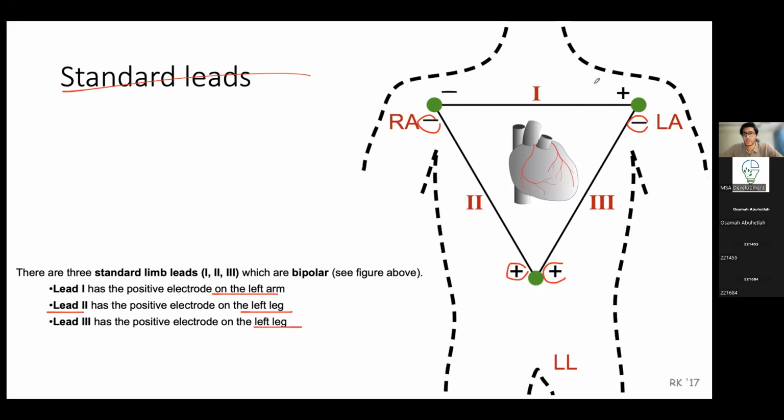So I really can't explain much here. You kind of just have to memorize this. You guys can come up with mnemonics if you want to. So we kind of just memorize this. These are the standard leads, leads 1, 2, and 3.